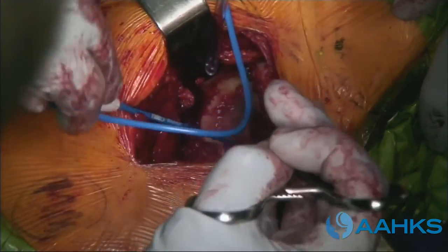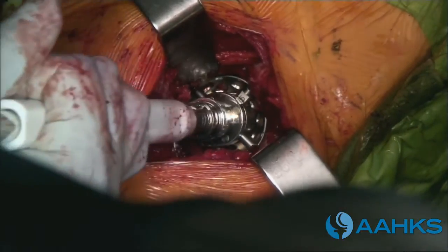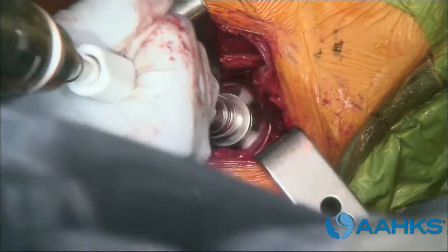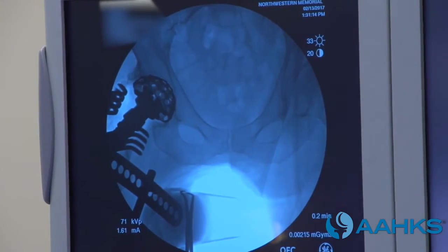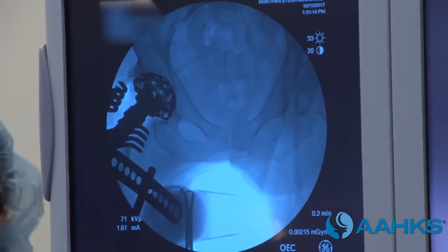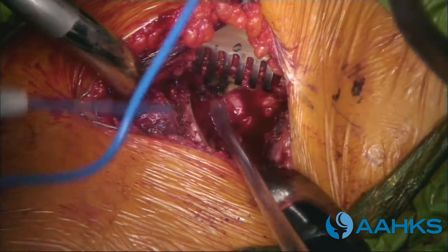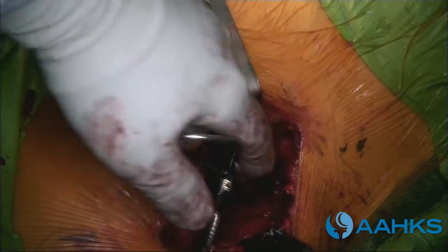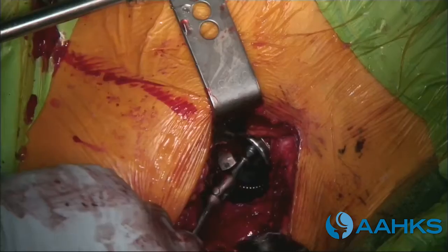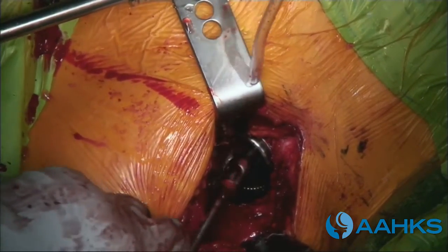Cartilage called the labrum is removed. Your surgeon uses tools to remove only as much bone as will be replaced with the implants. The hip socket is shaped in preparation for a cup, where the artificial ball will sit. The tools are set with specific measurements that match your anatomy. Bone spurs caused by osteoarthritis are removed so the implants are placed on bone and not the spurs. Once the cup is placed, your surgeon may elect to drill through the holes of the cup and place screws that will secure the cup to the pelvis.